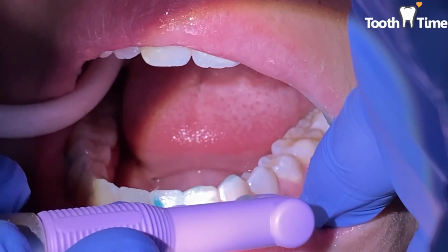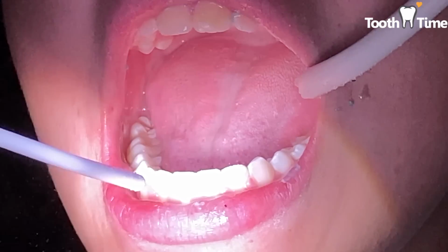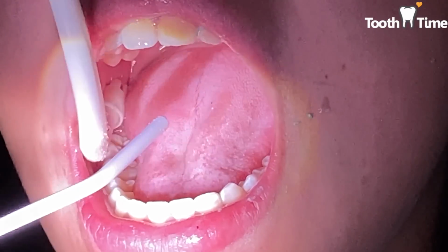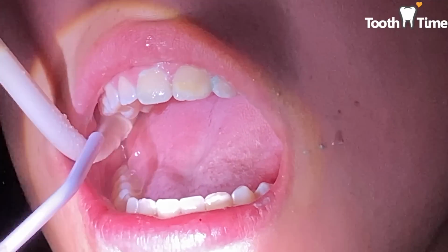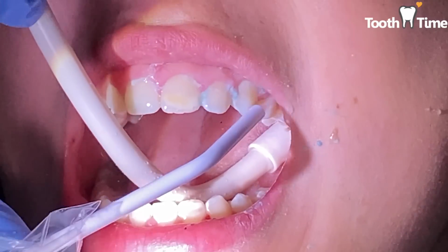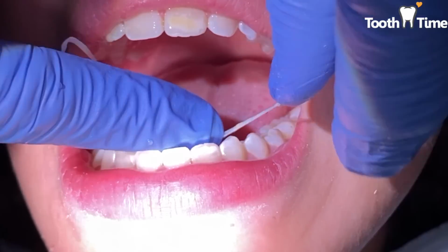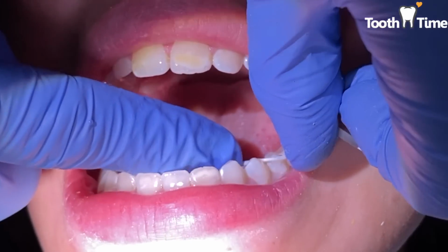Just like when the patient gets their braces put on, we do some records. We're going to go ahead and do that with our records whenever we take the braces off. So these are post records, and records are impressions of the teeth. That's going to help us get moldings of the teeth to go ahead and do the clear retainers. And then we're also going to do some x-rays and then a scan of her teeth and some pictures.